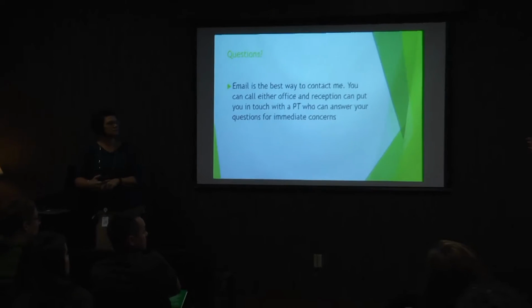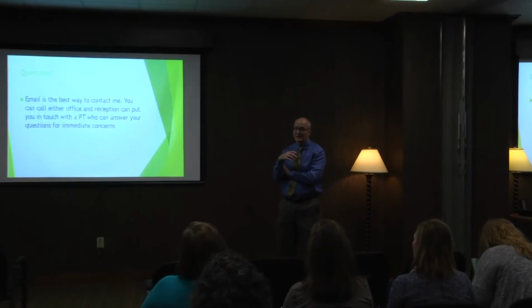Is it faster with Mako as far as doing the surgery? That's a good question. Originally, it was slower, because there's a bit of a learning curve. I'd say the first 20 were clearly slower. Now it's probably time neutral. You have to do a few more steps, but some steps you can do more quickly with more assurance. It's faster than navigation, which was that step between just X-ray and Mako, because I don't stop to wait for the computer to tell me as I'm doing it. I'm getting live feedback. Right now it's time neutral as we're approaching 100 cases. Before that it was a little additional time, though not dramatically. From the time we cut the skin to the time we sew up, it's now about an hour.